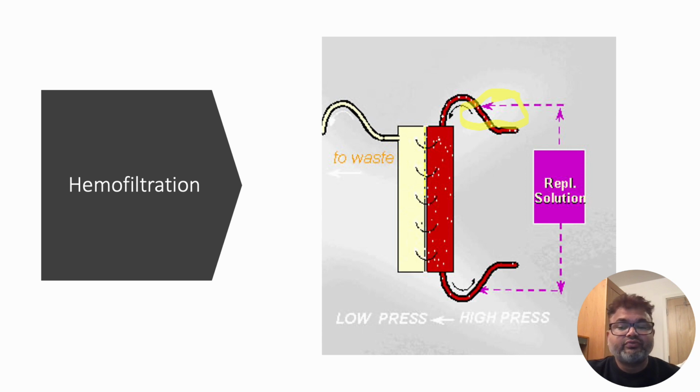And because of the blood and the mixed fluid and pressure, water will pass from one chamber to another chamber. Along with that water, solute will also move because of solvent drag, and this will go to the waste.